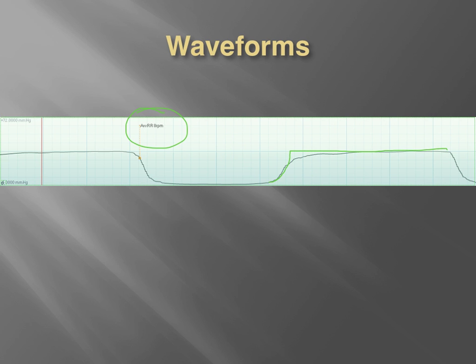Now with this waveform, you can see that it is relatively level. You can see a little bit of sloping, and maybe that's me looking at the monitor a little bit. But for the most part, we want that relatively square looking waveform. Unless the patient is symptomatic, I'm not going to get too excited about this little bit of slope here. But if it was, that little bit of slope would indicate to me that there's some type of exhalation delay.